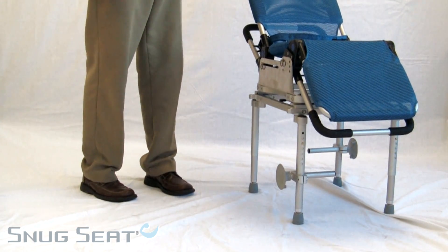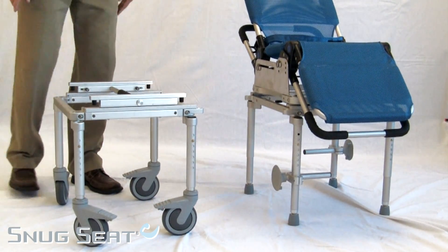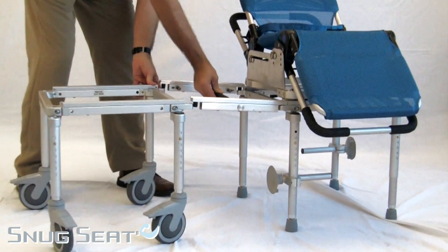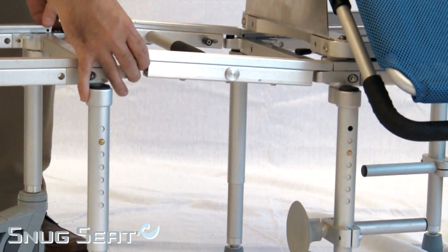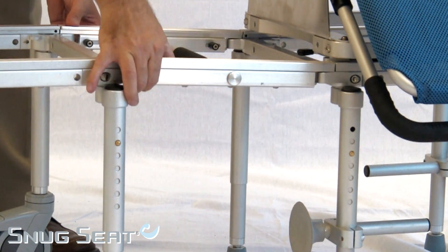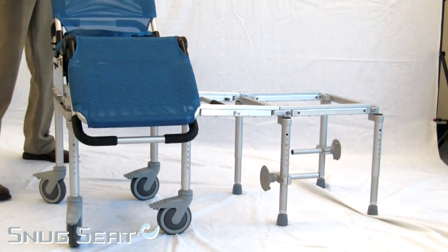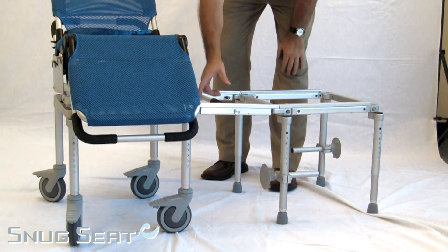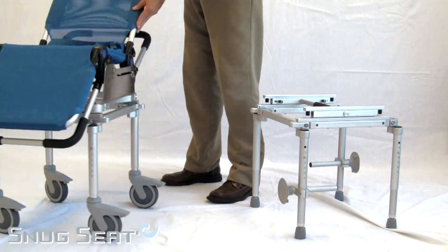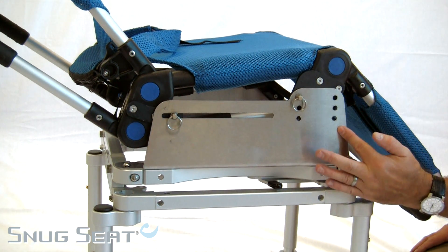To remove, you simply repeat the process by rolling the caster base into place, connecting the bridge, and locking it in place. Reversing the action, rolling the child safely and efficiently out of the tub. Remove the bridge and simply roll the child to a more convenient location for transfer.